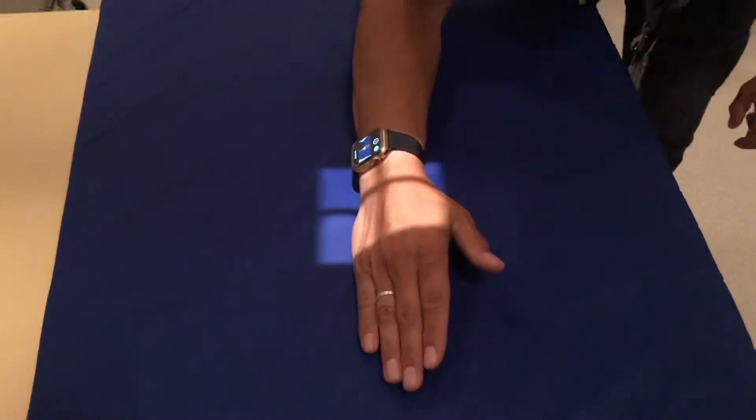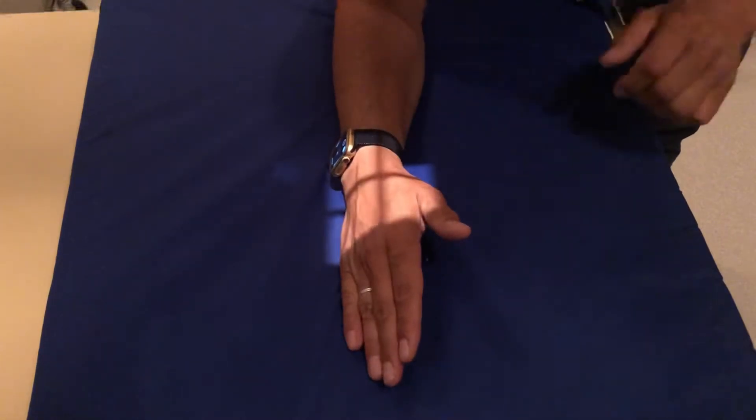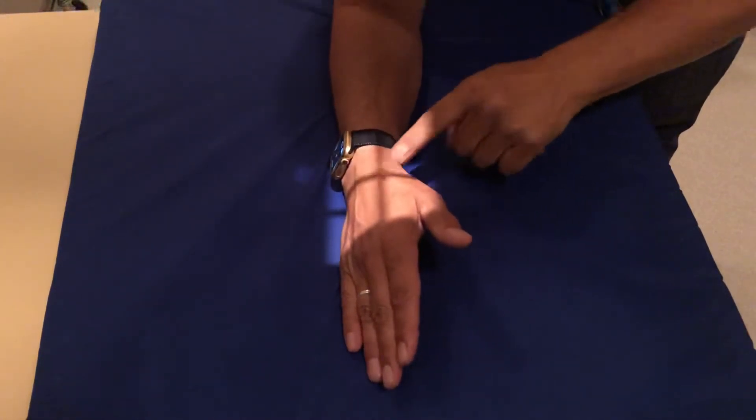For the second view, you're just going to bring it up about 45 degrees, and shoot right here where the wrist is.